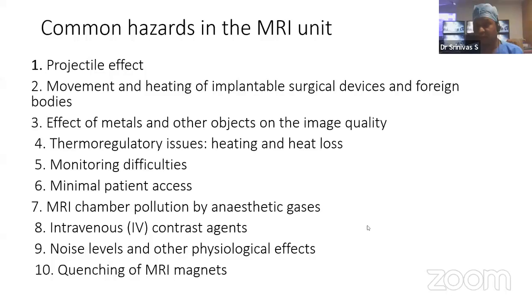And in patients who require anesthesia, the MRI suite can become a nightmare to the anesthetist, because you cannot approach the patient easily, and you have to prepare the patient beforehand to take for the MRI. And when we give anesthesia with anesthetic agents, the MRI chamber can also get polluted.